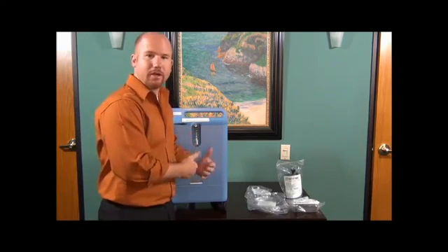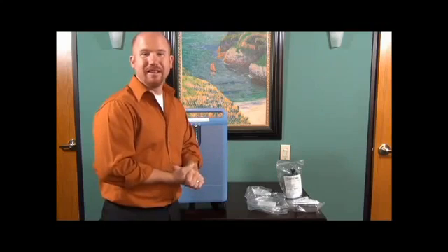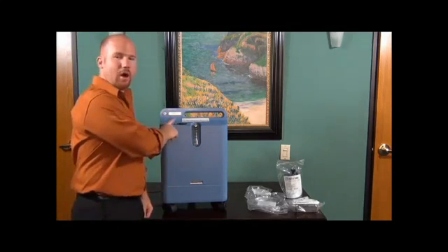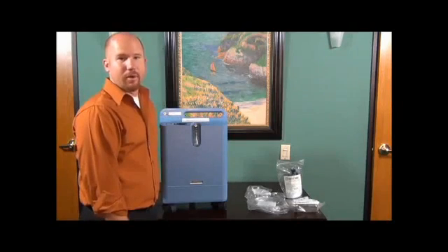So first of all, you want to plug in your concentrator to a wall outlet, preferably with nothing else plugged into that outlet, so all by itself. Then you'll turn it on. These lights will come on till it cycles through. Those lights then go off. This green light will stay on, telling you that it does have power and that it's running properly.